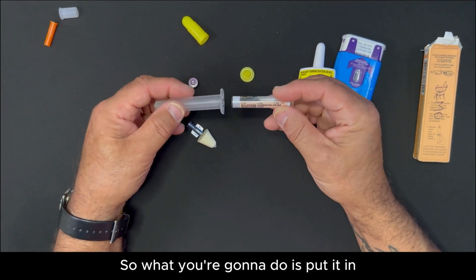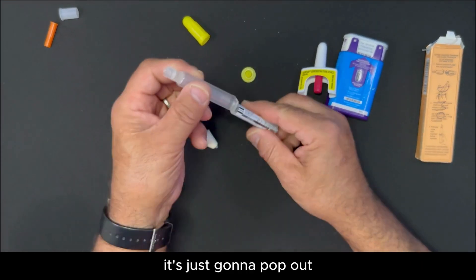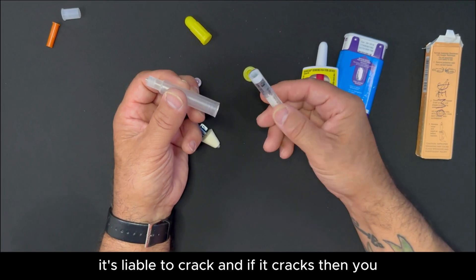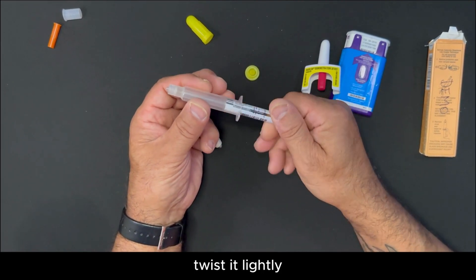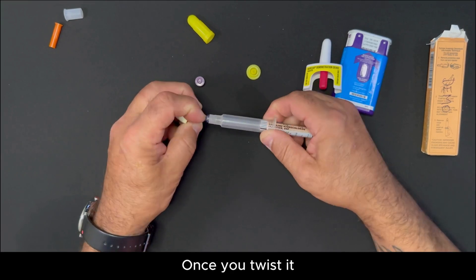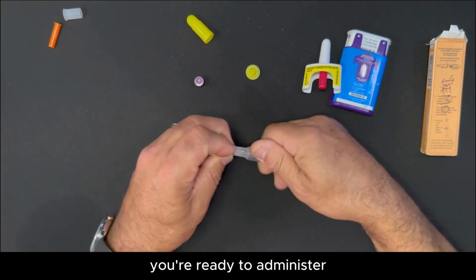What you're going to do is put it in and twist it a little bit. If you don't twist it, it's just going to pop out. If it hits the ground, it's liable to crack, and if it cracks, you've lost a dose. So put it in, twist it lightly, grab the atomizer, and on the smaller end, put it in and twist it also. Once you twist it, you're ready to administer.